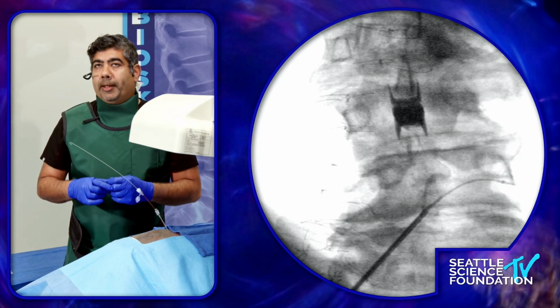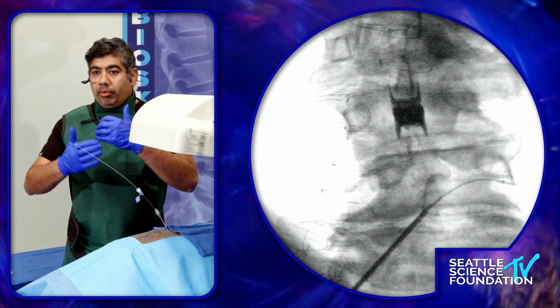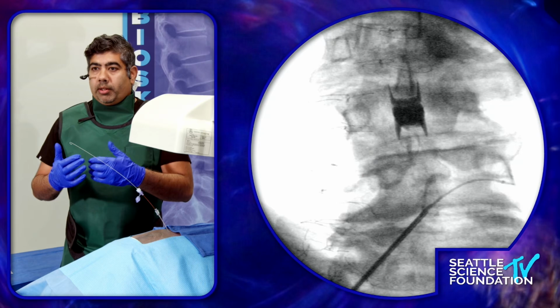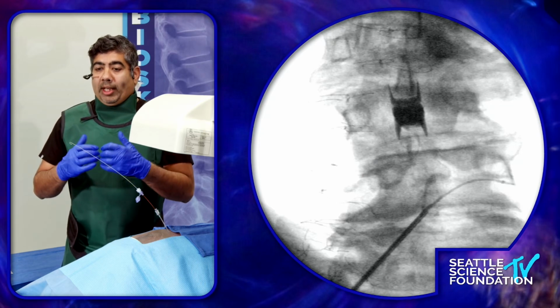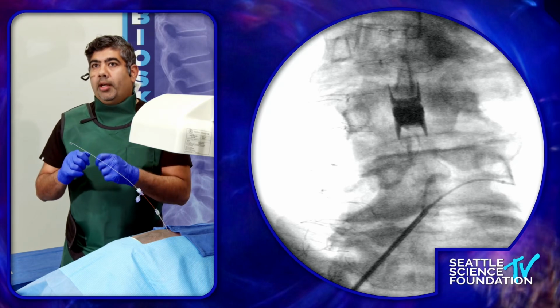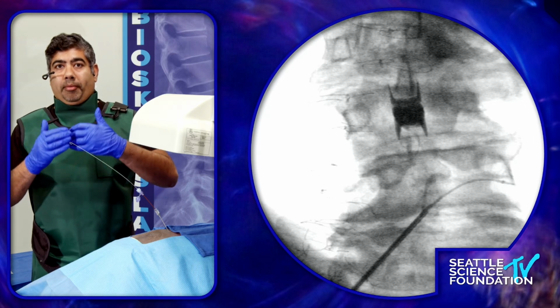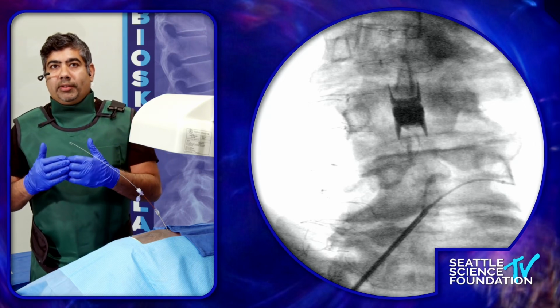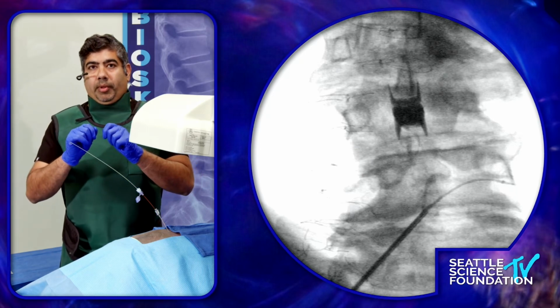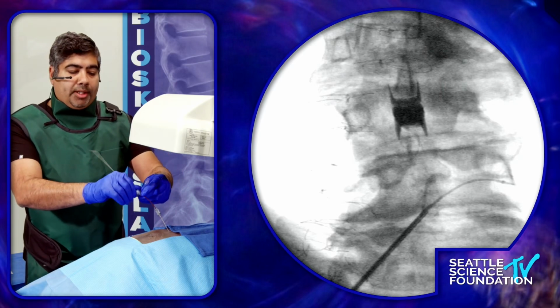Ramo described that diagram very well, and one of the key things here is to remember that there are two layers of the intraforaminal ligaments. Sometimes you feel the first pop, but that's probably not enough. As you drive this delivery system carefully, you basically get the first pop and then the second resistance, which is the second layer of the intraforaminal ligaments. So it's important to go a little bit further in gently so you can feel that second pop.